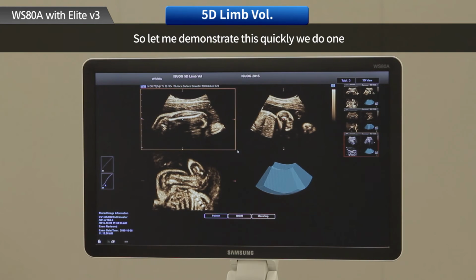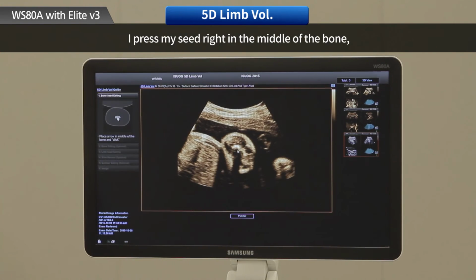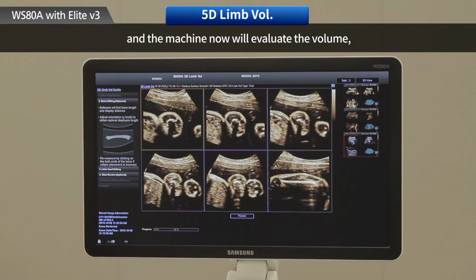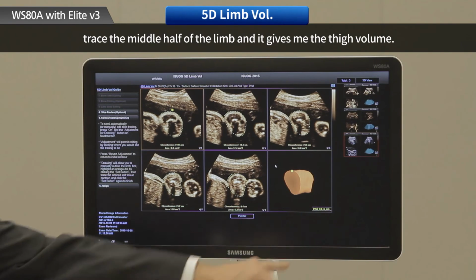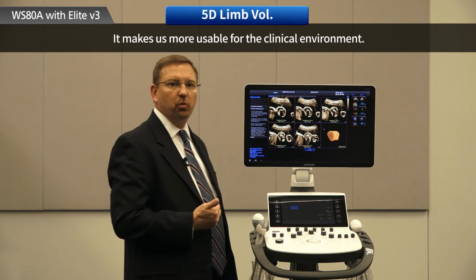So let me demonstrate this quickly. We do one sweep through either the thigh or the arm. It works on both. And I simply press 5D limb volume. I place my seed right in the middle of the bone. The machine now will measure the limb for me. I tell it it's a thigh, tell it to do it automatically. Place my 2 seed points in the axial plane. And the machine now will evaluate the volume, automatically trace the middle half of the limb, and it gives me a thigh volume automatically. This, what used to take manually anywhere from 2.5 to 3.5 minutes, can now be done within 10 or 15 seconds. So it makes this more usable in a clinical environment.